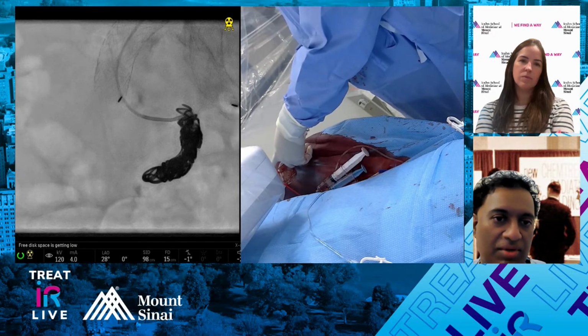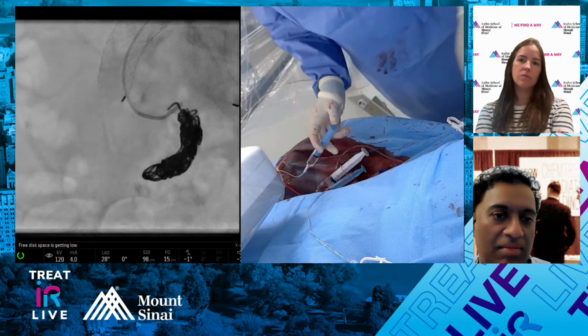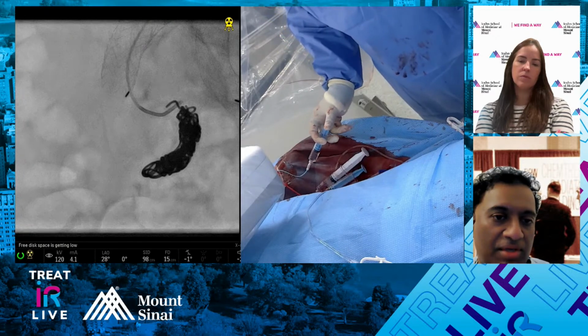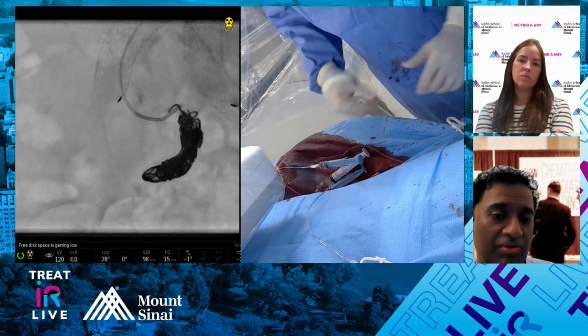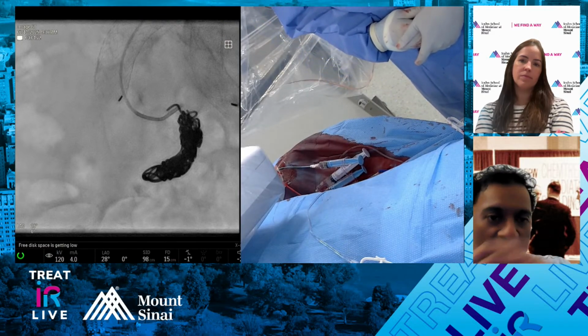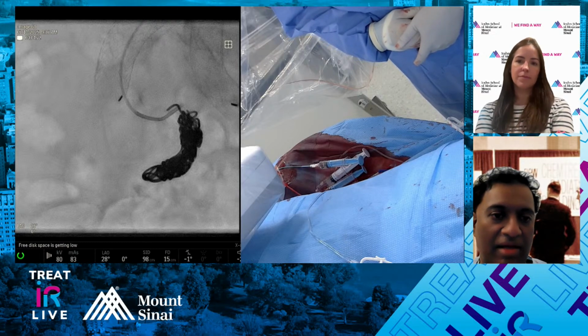Most of the stents that we use in this area are going to be like a Gore limb. The minimum diameter is usually 12 French. So that way you'd have to go transfemoral. But what you could do is get an 8.5 guiding sheath, and then through that, put a 6 French sheath and deploy the plugs, then come back, go up to the limb, and then stent it. So there are a few options from that approach.